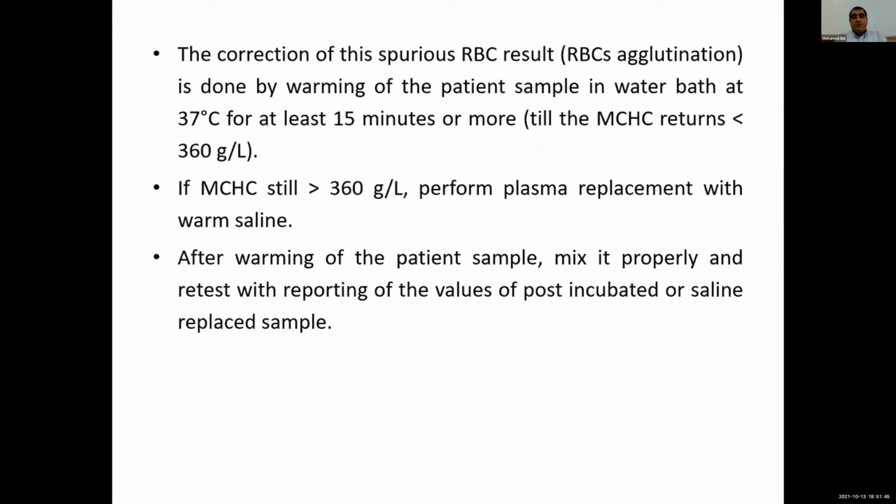So by warming of the patient sample in water bath or by using warmer at 37 degrees centigrade for at least 15 minutes or more till the MCHC returns back to normal and be less than 360 gram per liter. This is the crucial solution of this spurious condition.